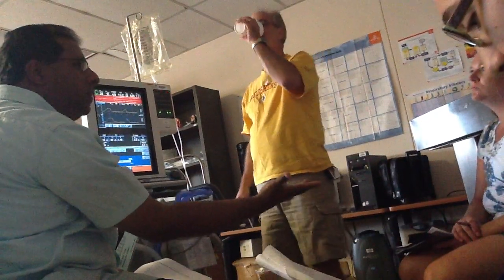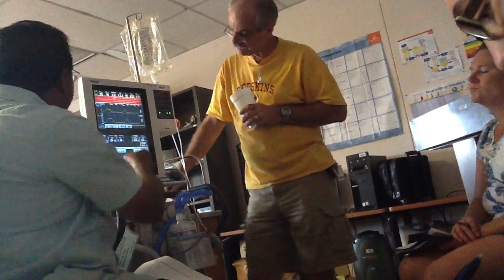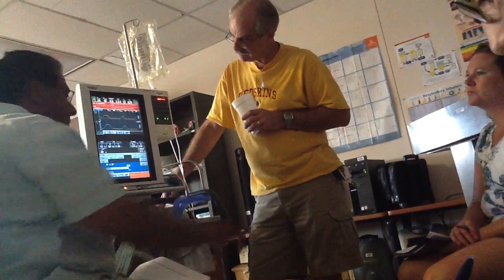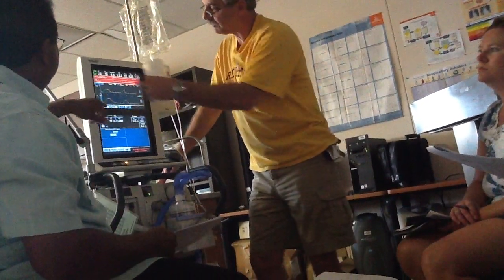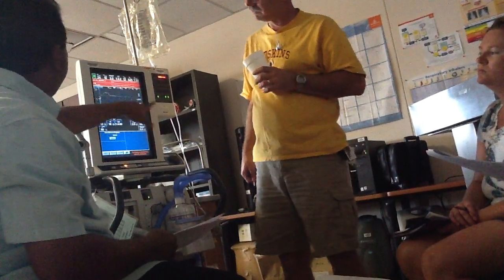Are you ready to put this patient on yet? Press accept when you finish, it says. Now the patient is getting ready to go on pressure control. Accept. Boom. Done. Look at that. That's okay. Nothing to do with that.